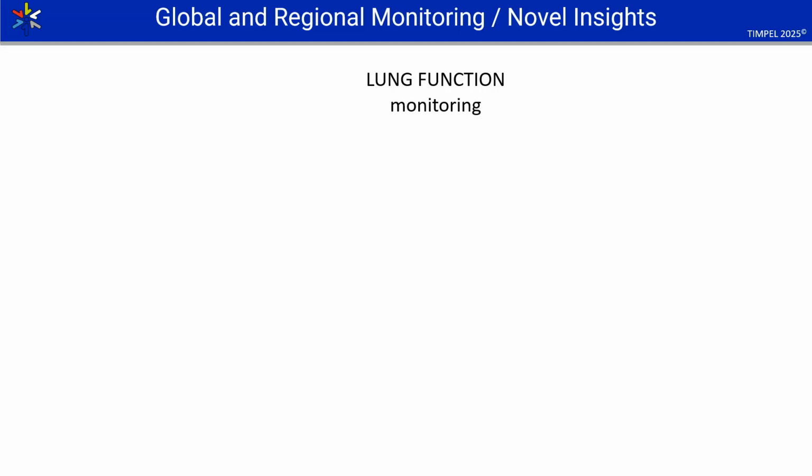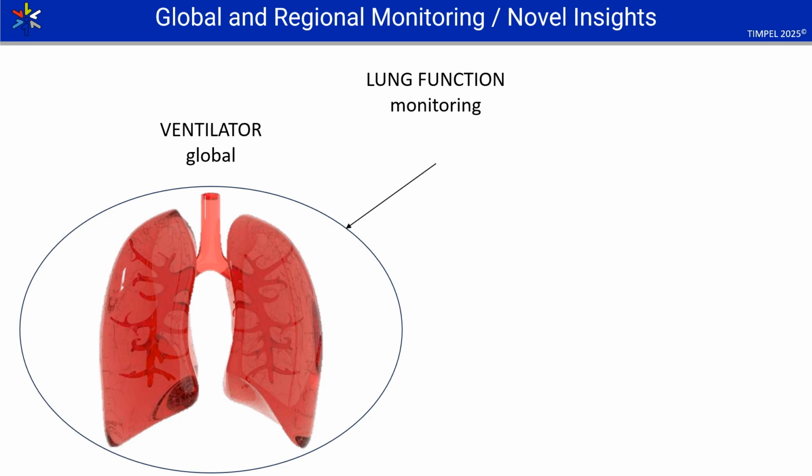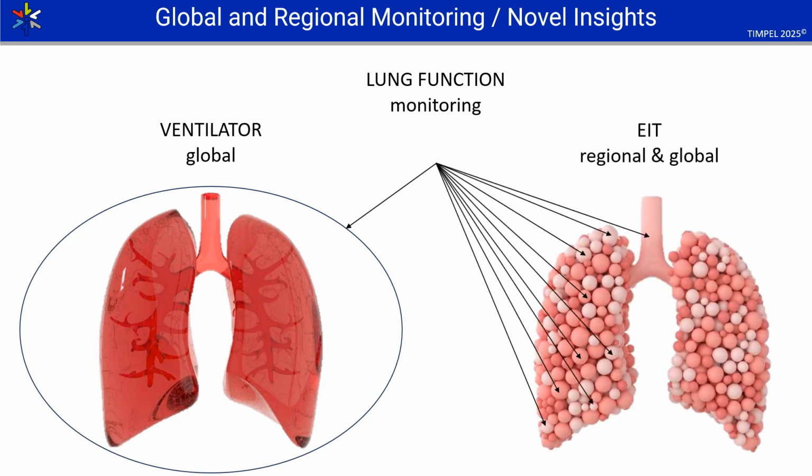Mechanical ventilators typically provide only global averages of ventilation parameters. However, lungs are heterogeneous, and this heterogeneity increases when lungs become diseased. EIT continuously monitors regional lung function, providing deeper insights and enabling individualized ventilation management.